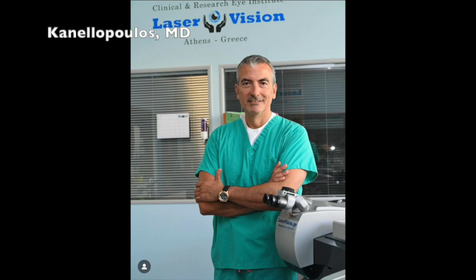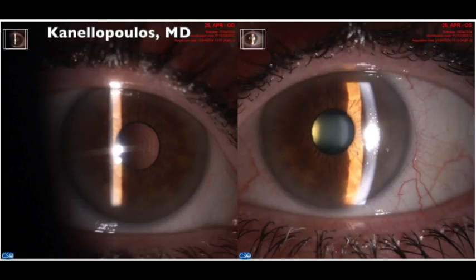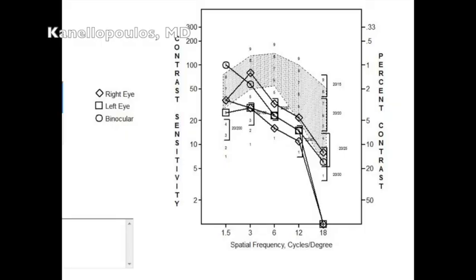We're going to see a 61-year-old physician who had a trifocal lens placed on her right eye, thinking that eye was her dominant eye, and I actually made this presentation in Rio de Janeiro just last week. So we can see here a perfect surgery. Unfortunately, her uncorrected visual acuity is just 20/25 minus, and this is her contrast sensitivity.